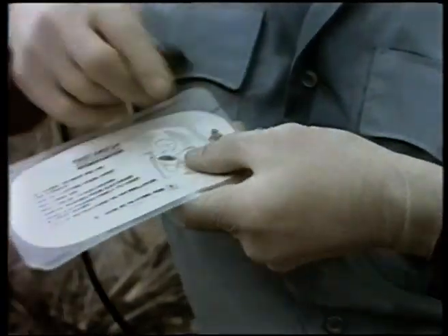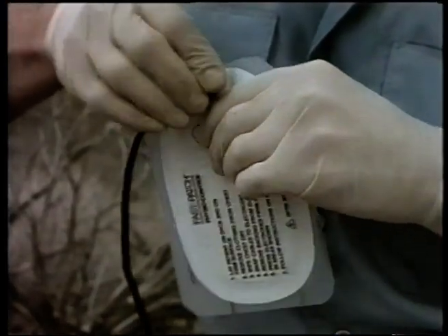Open the defibrillation electrode package and remove both electrodes. Next, attach the patient defibrillation cable to the electrodes by snapping the cable ends onto the electrode posts.